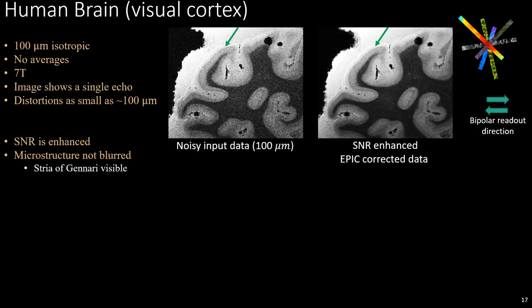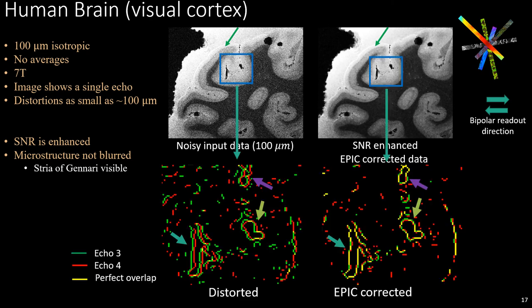Finally, we look at a single echo image of an ex vivo human visual cortex at 100 micron isotropic resolution. EPIC improves the SNR without blurring subtle microstructure such as the stria of Gennari, highlighted with the arrow. To analyze edge alignment across echoes, we visualize anatomical edges of the third and fourth echo in green and red respectively. They are separated in the distorted data but align and become yellow in the EPIC corrected data, demonstrating successful distortion correction of displacements as small as 100 microns.